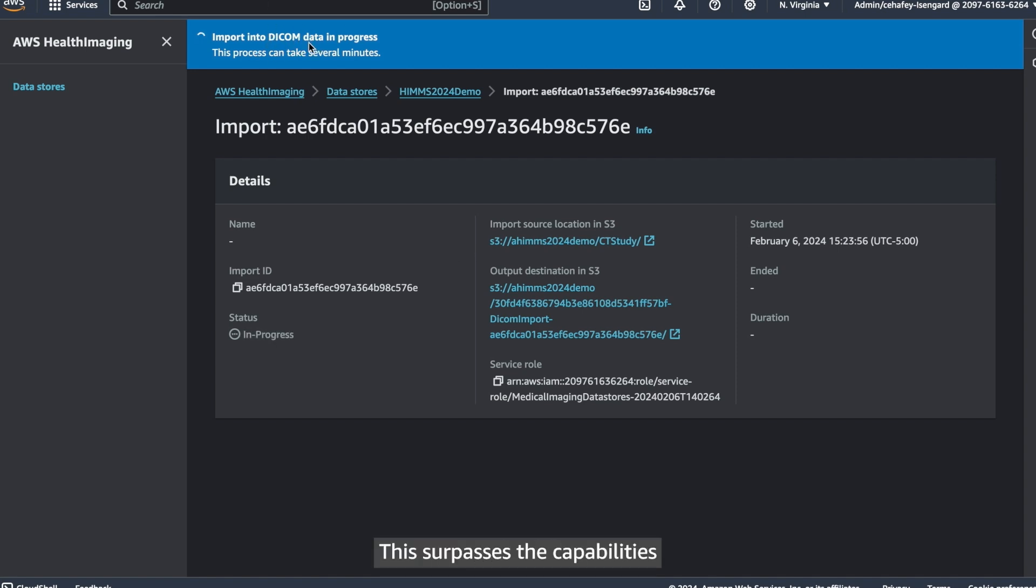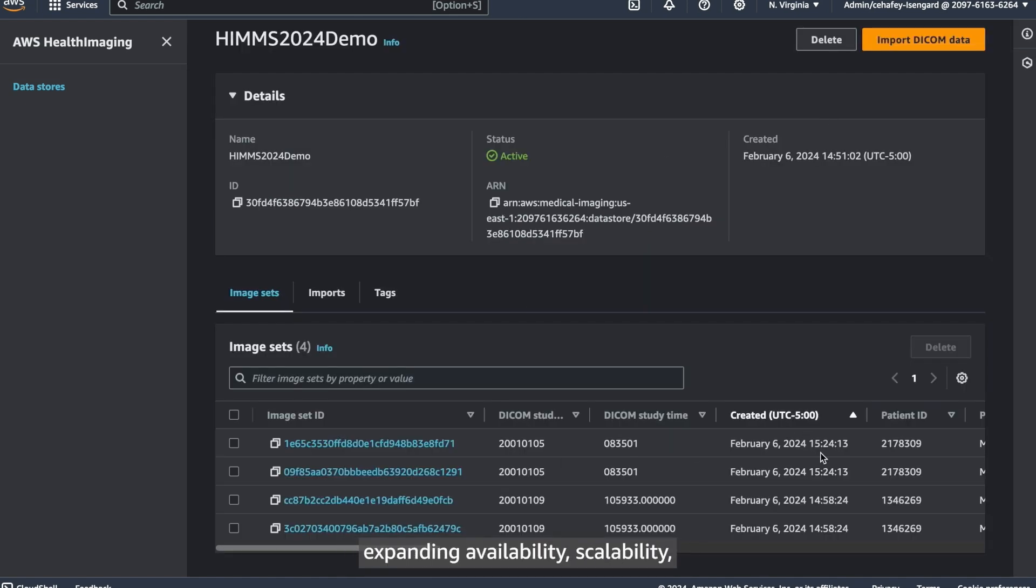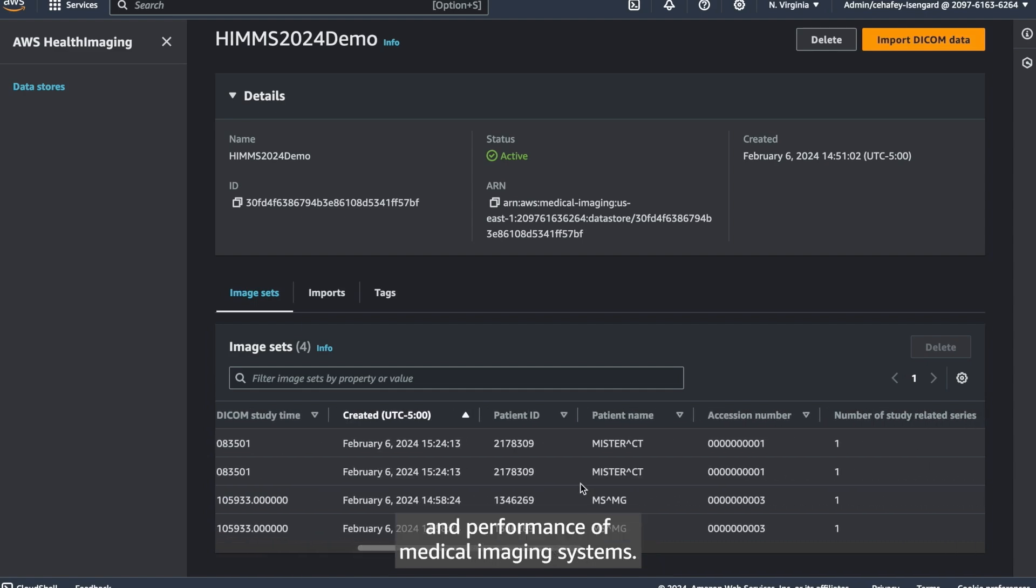This surpasses the capabilities of traditional enterprise-packed systems, expanding availability, scalability, and performance of medical imaging systems.